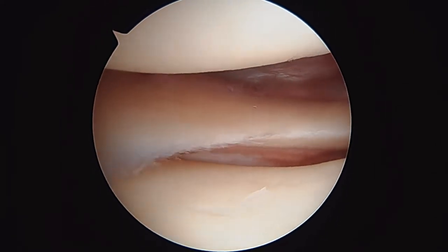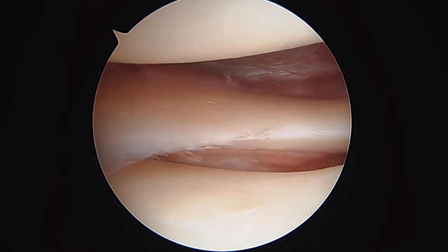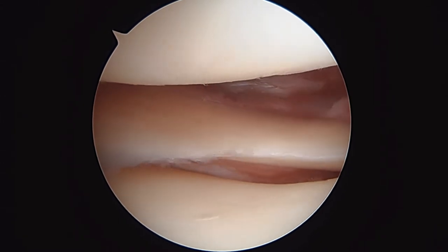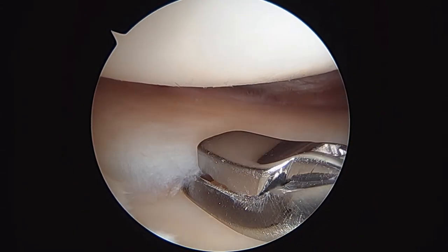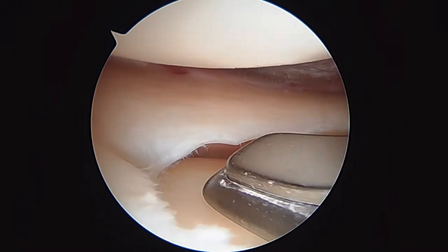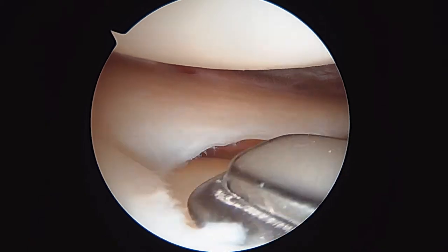Can I get a little biter? I want to make sure these edges are stable and that there's nothing that's about to tear. A lot of times the best way to do that is with this instrument right here. I'm not trying to take off much at all — just want to make sure we have a clean edge.